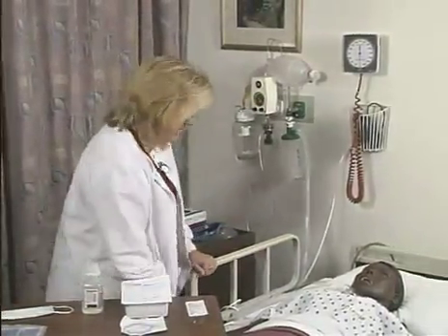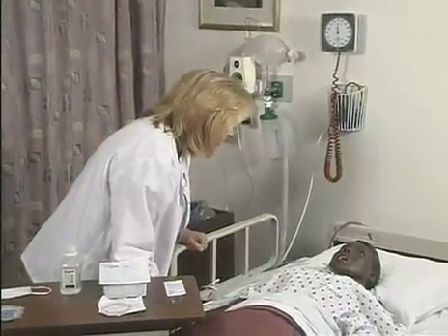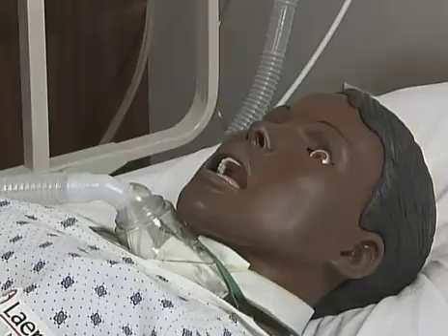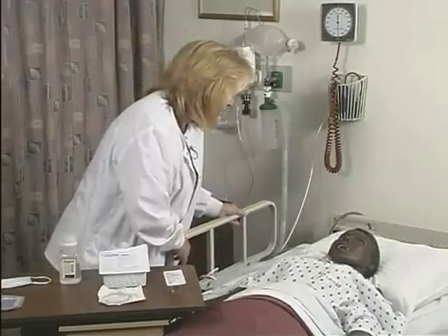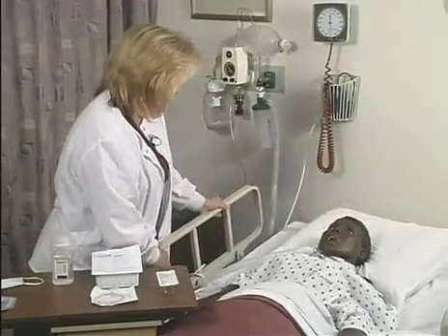Now I'm going to introduce myself to my patient. Good morning, Mrs. Jones. My name is Kathy and I am going to do some tracheostomy care and also suction. I need to raise your bed in the semi-Fowler's position.